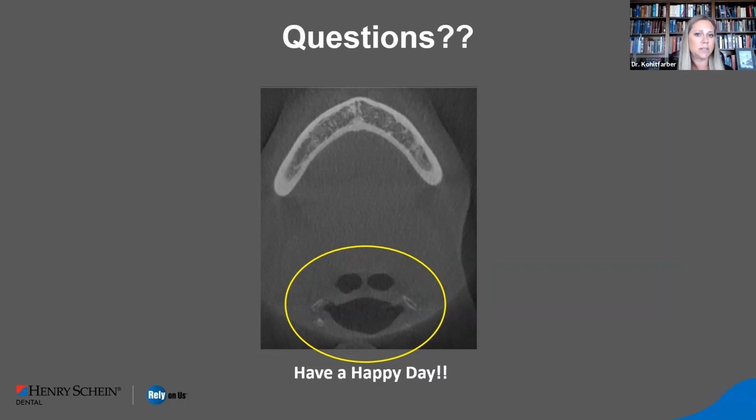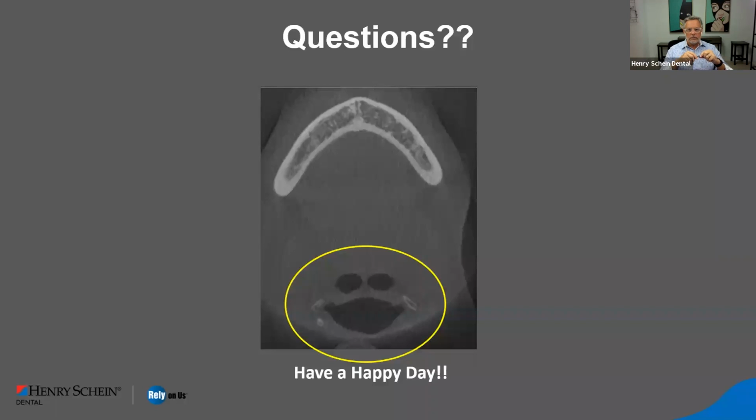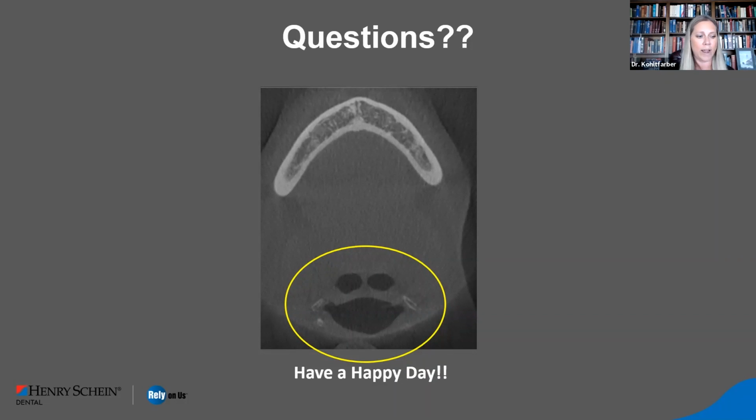With a cone-beam CT, we don't have that highly collimated fan beam that we have with medicine. We have a lot of scatter. And because of that, we actually don't have the true density that we have with medical CT. With our CBCTs, we're just looking at gray values, and there's a randomized feature to that, where that same patient sitting in that machine at two different time points will have different gray values. And it's going to make it much more difficult for an AI segmentation tool.